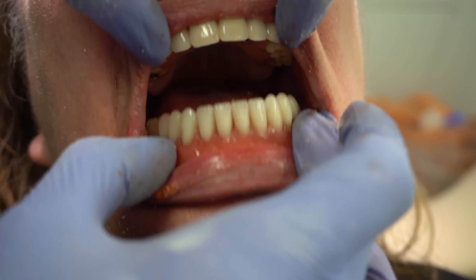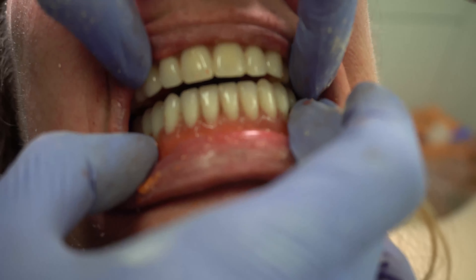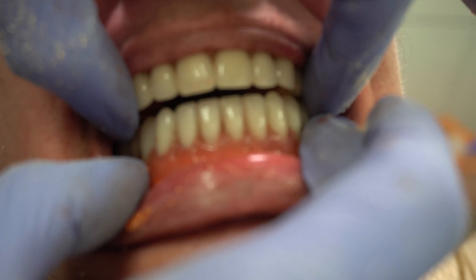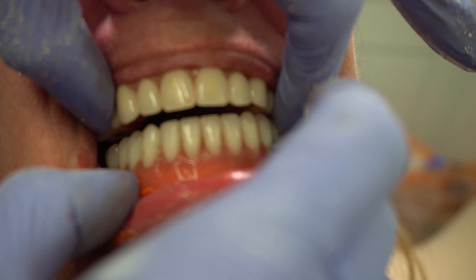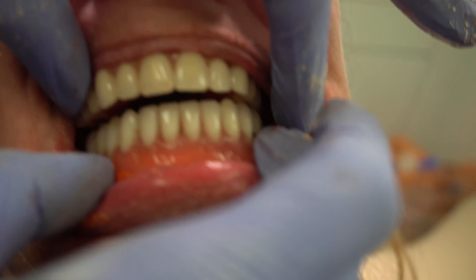And it's just a case of fitting the teeth — no waiting around or anything like that. And the teeth you get are much stronger than if we had fitted them on the day. In theory, this way of doing it has got a lot of advantages, but we don't always get it right. Here's the situation where the bite was a little bit out, so the teeth have to go back and have them readjusted, and then we fit them so we don't have a bite problem like we've got here.